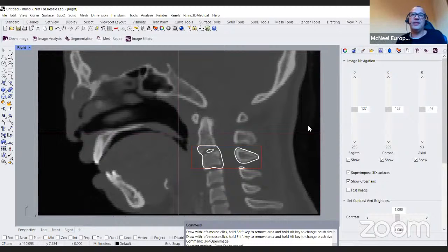Jose Alberto Blanco Fernandez has two questions. How many files, how many models can you segment at the same time? And how could you automate the segmentation? I guess you could use Grasshopper for that. Yeah. And how many models at the same time?